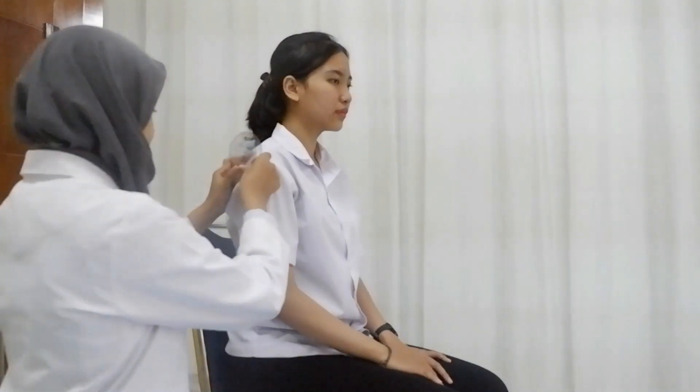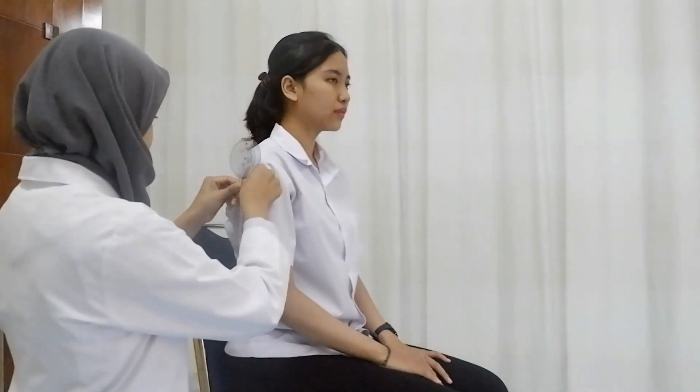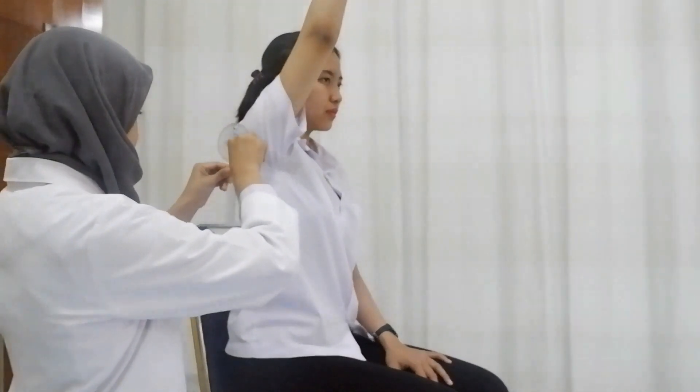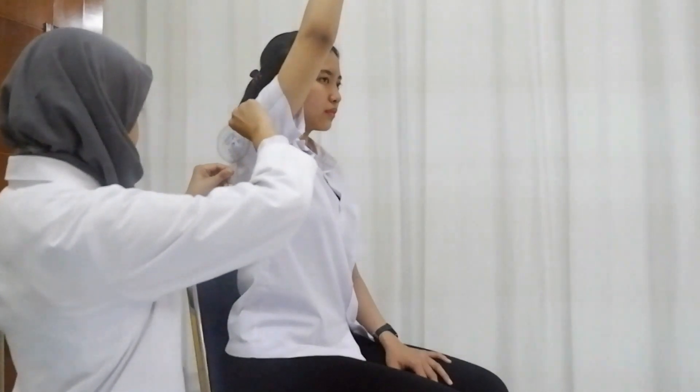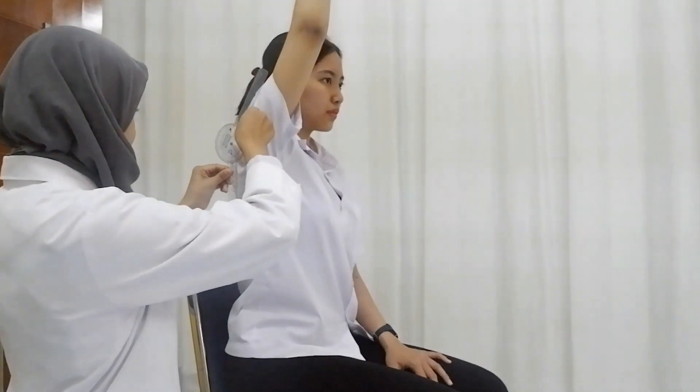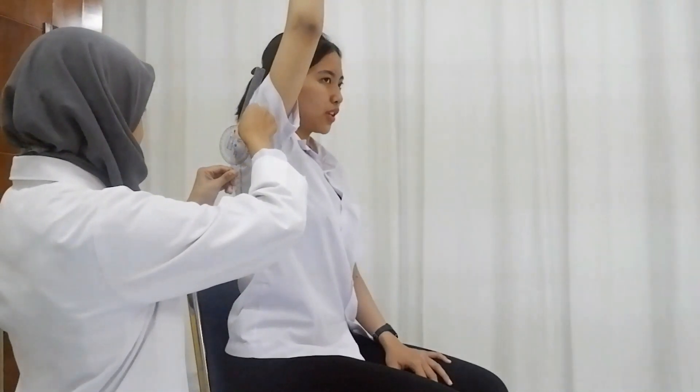Patient is in the sitting position with the humerus in neutral. The position of the examiner is on the side of the patient. The axis of the goniometer will be at the acromion process, with the stationary arm parallel to the trunk and the moving arm in the middle of the patient's arm.